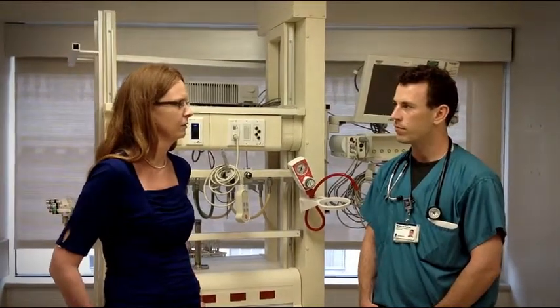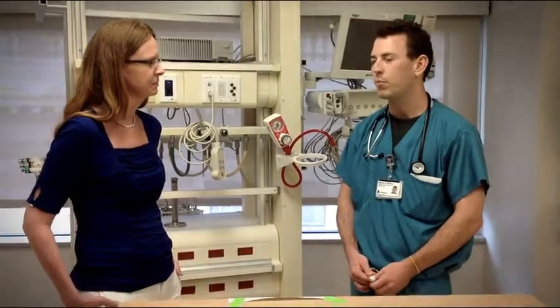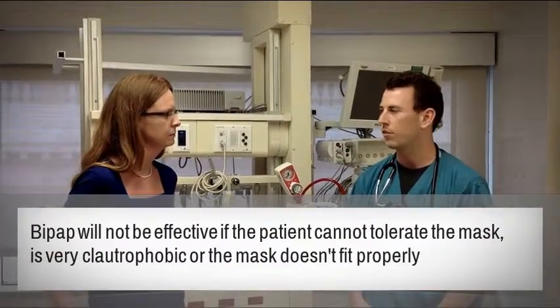Okay. But it doesn't give them a breath, so if the patient's not breathing, then clearly BiPAP's not a good option. Yeah, that's the main thing. If the patient is not breathing, BiPAP isn't the best option, but it can breathe for them to an extent. But then you have to deal with leaking around and just issues with the patient's lung compliance. They could have real stiff lungs that could require intubation.